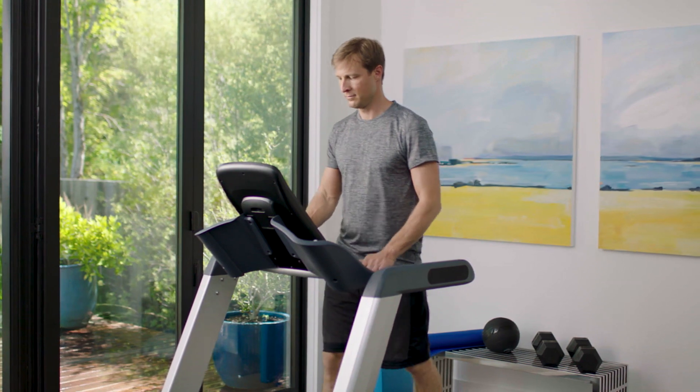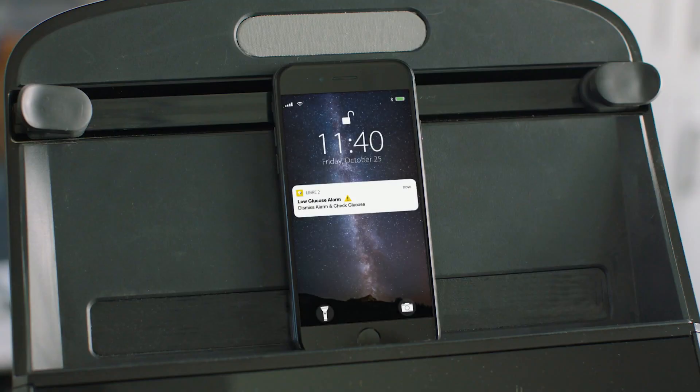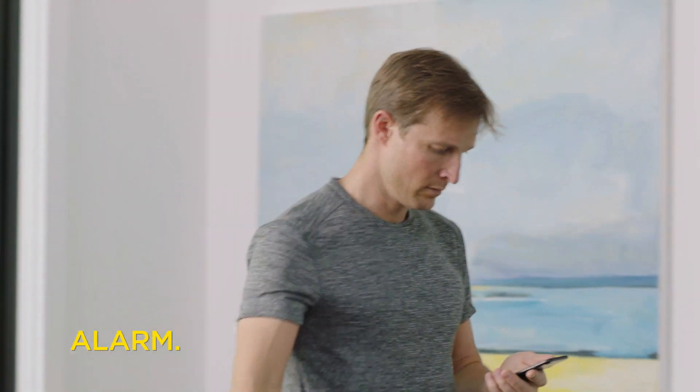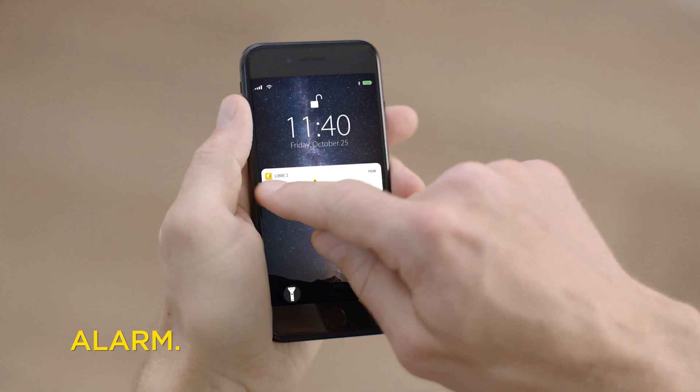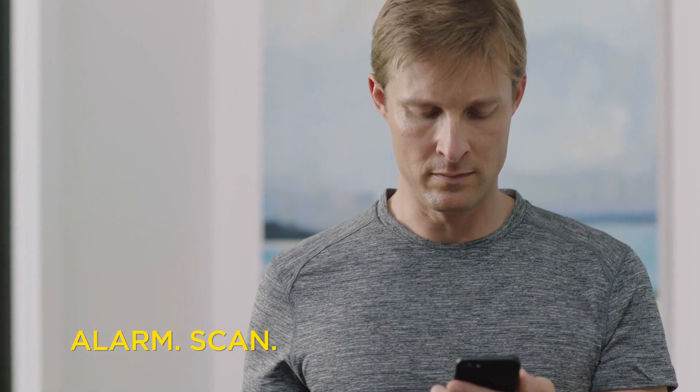Make sure you have the Freestyle Libre 2 app running in the background, otherwise you won't receive glucose alarms. When the alarm presents a notification on your phone, just swipe to open the notification and then scan the sensor with your phone to see your current glucose reading.